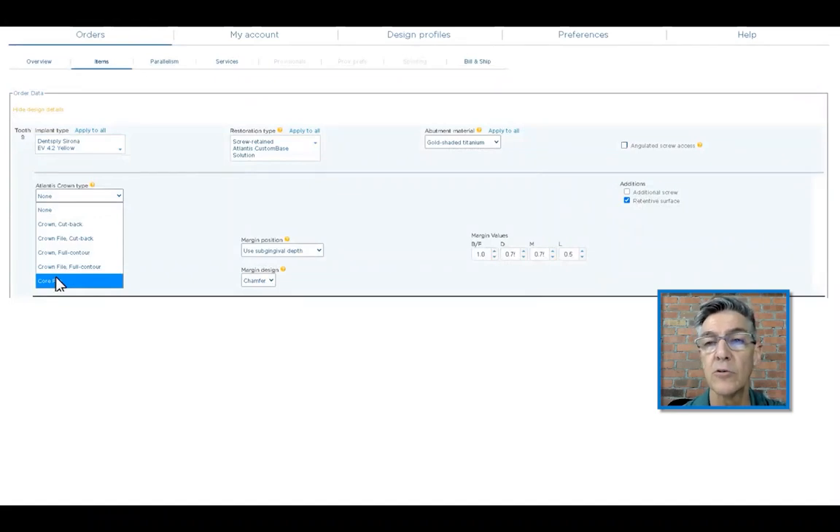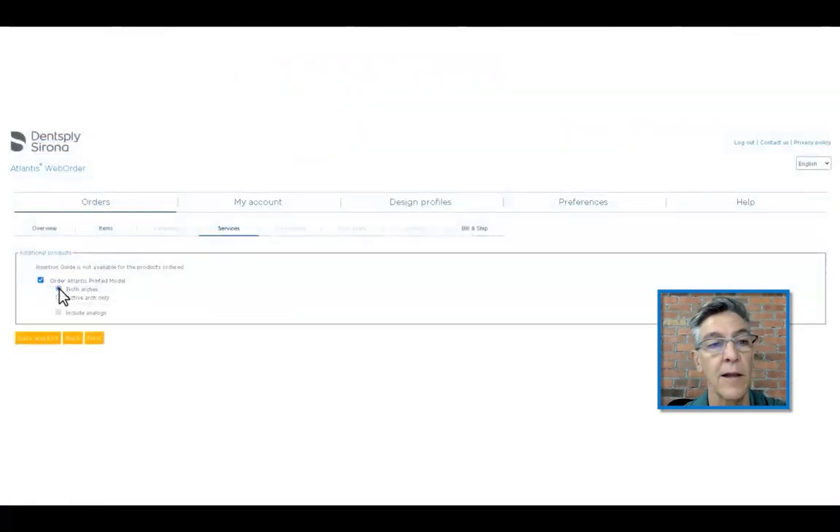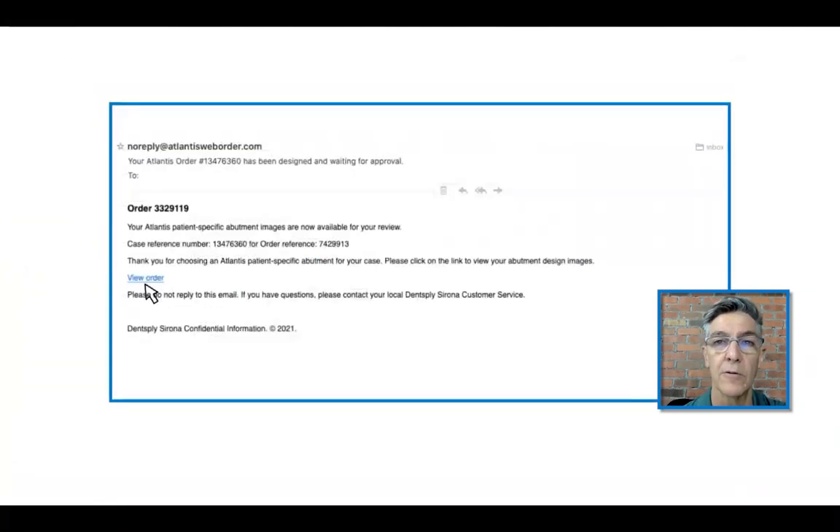They're going to choose the core file, which allows the laboratory to work on the actual restoration before receiving the abutment because they have a copy of it. Once you choose core file, it also activates the angulated screw access box, and as I suggested for the number nine site, we want to use this. When done, we hit next. The laboratory can then decide if they want to make their own models, printed models, or have Atlantis make them. They decide, they order, and off it goes.